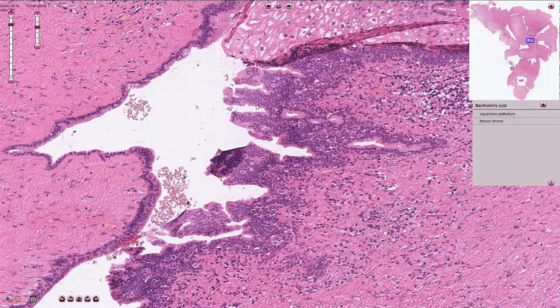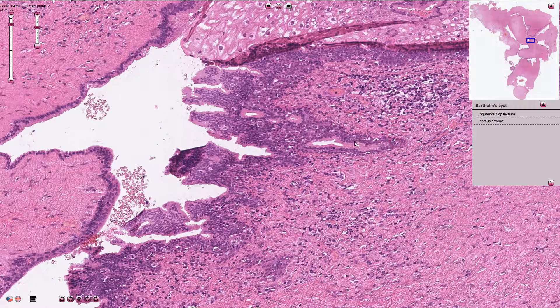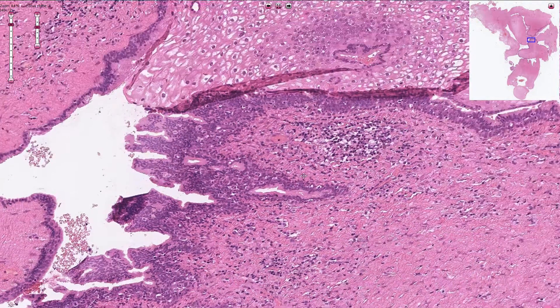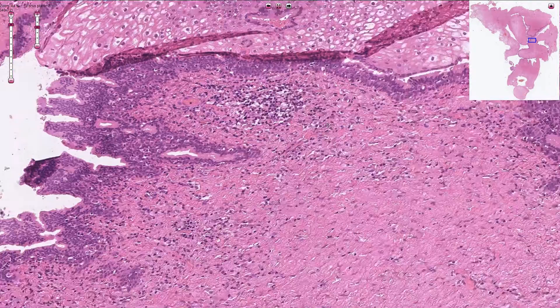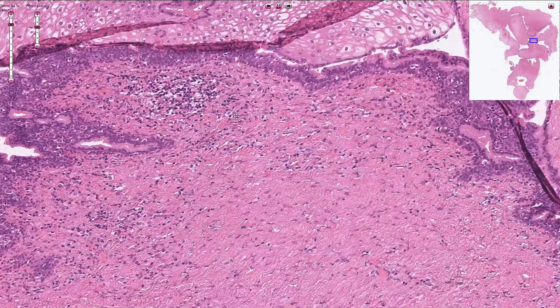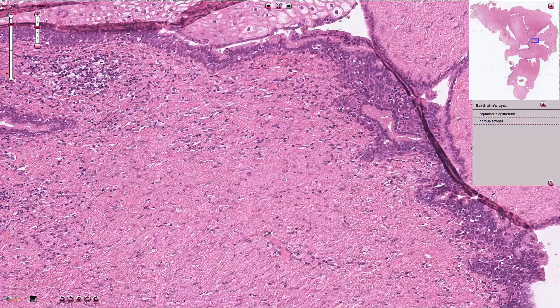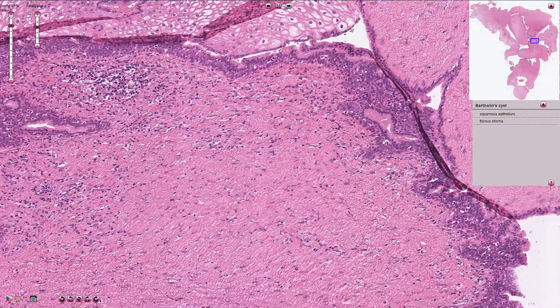In this part we can see that the wall of the cyst is lined by a transitional type of epithelium, and here we see something that looks like residual mucinous glands, which is quite important for the diagnosis of Bartholin gland cysts. A similar structure can also be seen here.